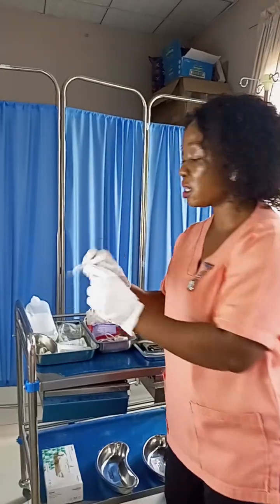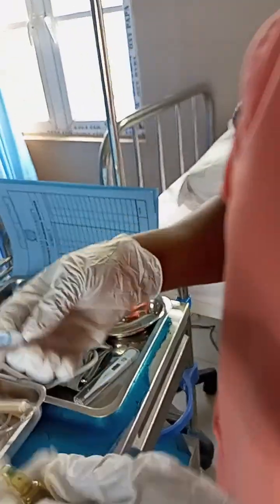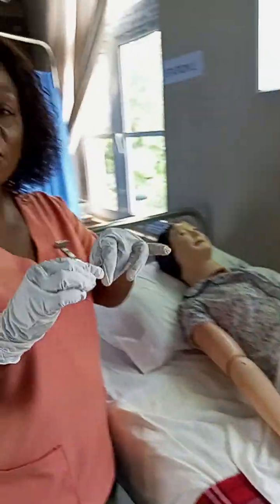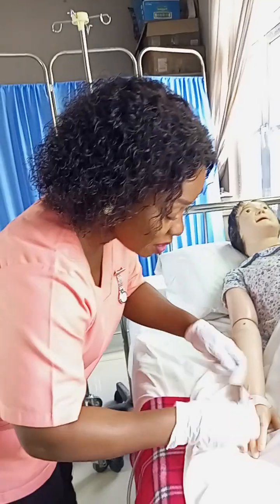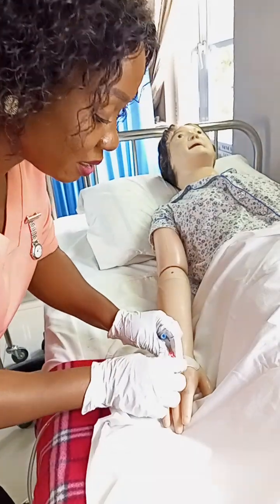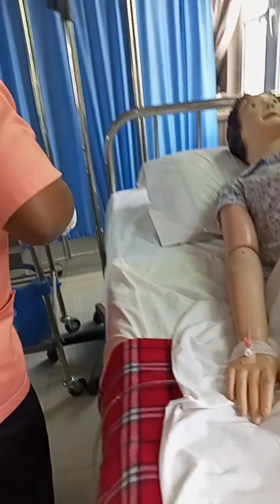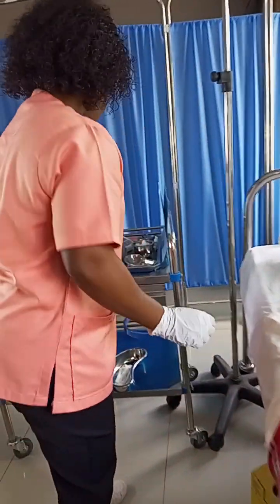So, break the medication. Withdraw the medication, of course. Discard it, and then I break and I withdraw my medication. The next thing is for me to administer this medication. So I open the cannula, administer the furosemide. I'm done. Then I close immediately. The next thing is I will discard into the sharps box.